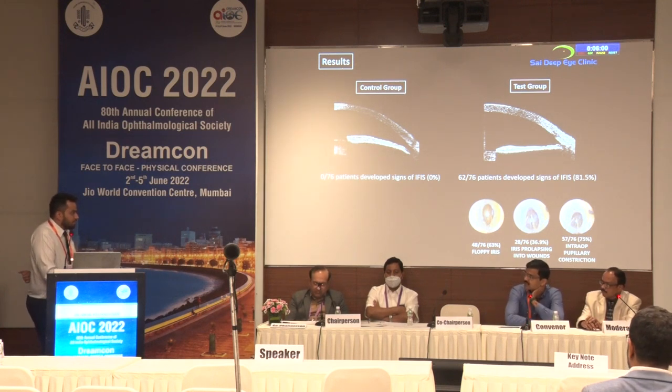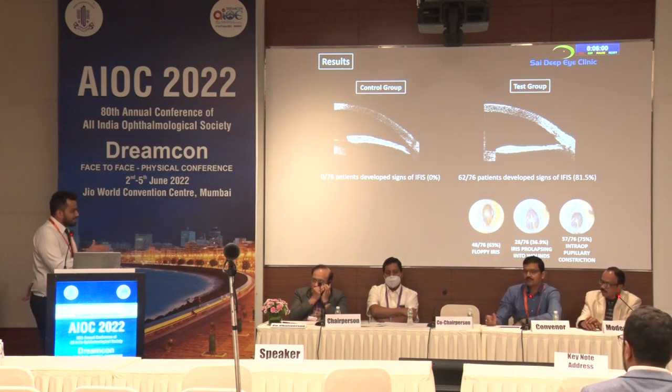You know that it's a challenging case which you're going to take up right now. You know that there is going to be some signs of floppy iris during the surgery. So is that what this surgeon also knew? No, this surgeon did not know preoperatively. As I said, it was a blind study. He did not know that the patient was on tamsulosin at all. I think you said yes to that, so I asked this question. It was a blind study. So the surgeon did not know that the patient is on tamsulosin.